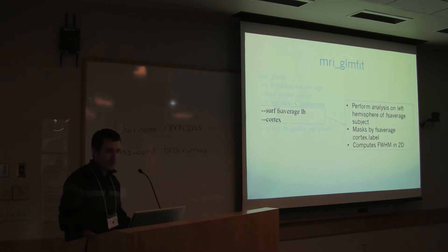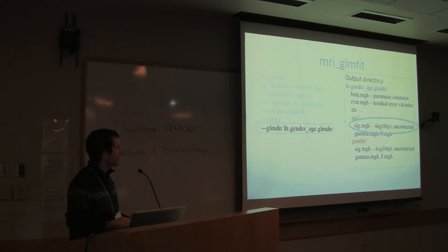These are two options to specify that we want to run the analysis on the surface using fsgd on the left hemisphere. Cortex tells the program that it's going to use cortex.label to mask analysis, essentially to leave out the inner wall of the hemisphere that we know is meaningless. And this is just the output. The output is a directory where the program will write all the information that we want to display afterwards.